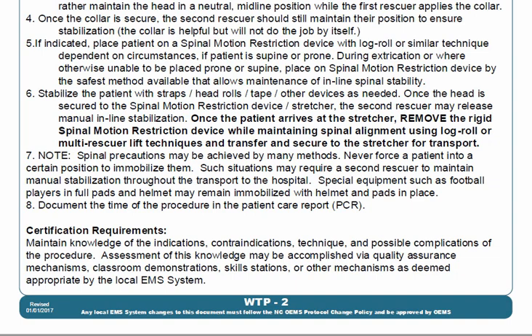With rolling the patient over from a prone position onto a device, which would be onto a spinal board so you can move them again, the recommendation is to perform a log push to roll the athlete rather than pulling them over, because it's a little bit better to maintain the immobilization of the spine with pushing them over.